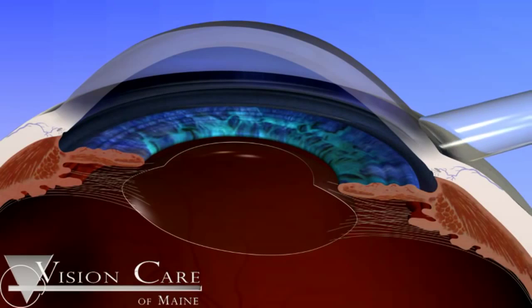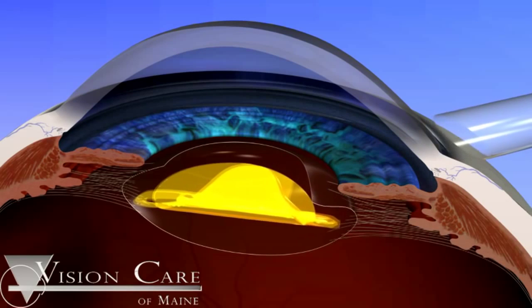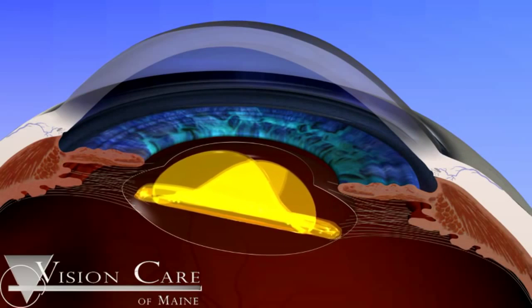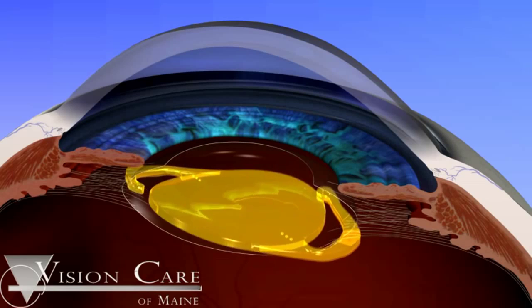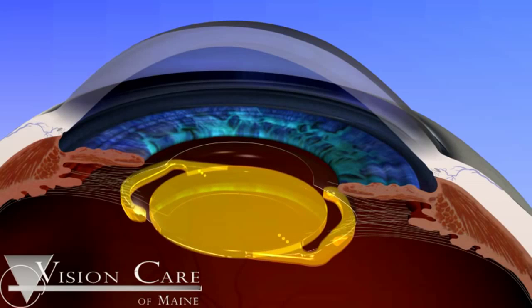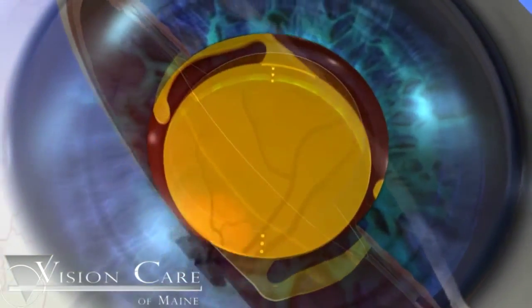After the axis marks indicating the location of the steep axis are placed on the cornea, the surgeon implants the single-piece ACRISOF IQ Toric IOL into the capsular bag using the same method employed for routine capsular bag implantation of a traditional monofocal IOL.